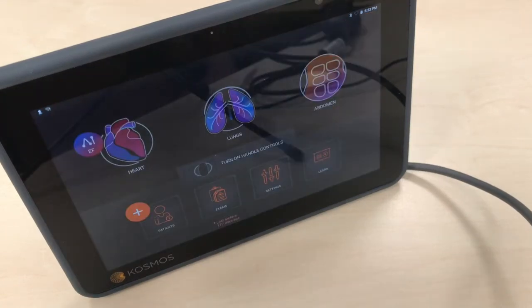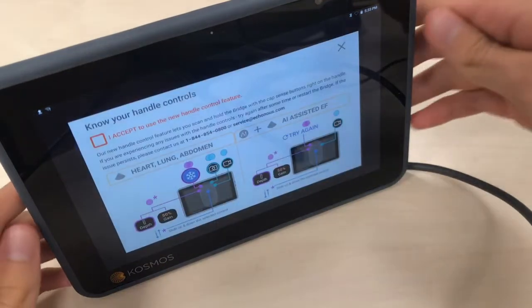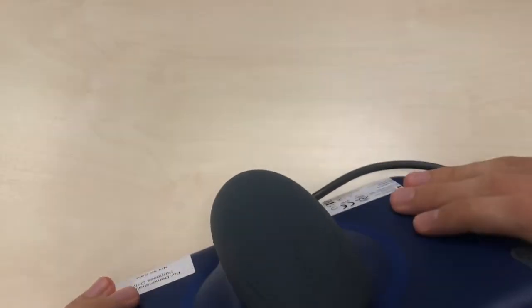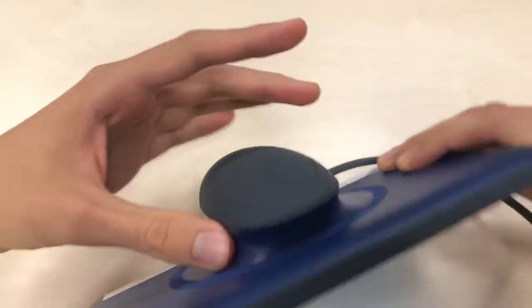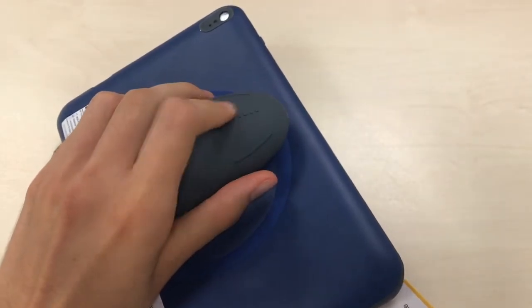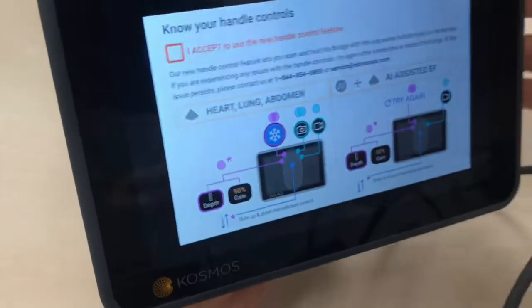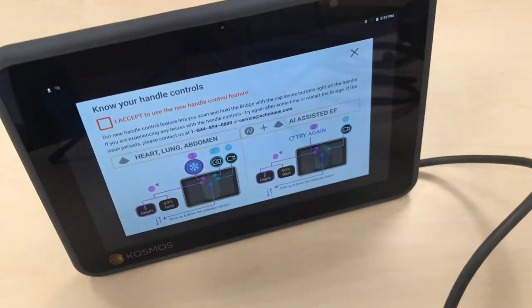There's another interesting thing which is these special controls on the probe. If you click here you're able to manage the tablet with the controls directly from the probe handle — this is a click, a slide, and another click. Since you can hold the tablet like this, you have one finger here, another one here, and this is the slide. This can be really useful in case you don't have anywhere to put the device and have to hold it with your left hand.